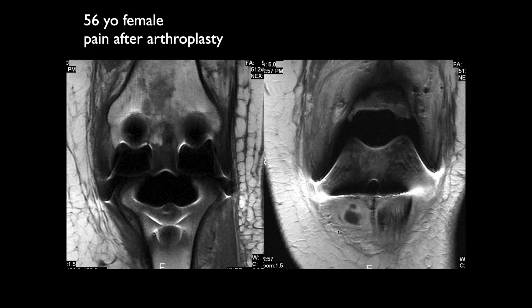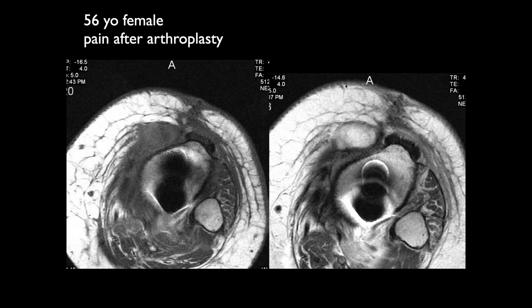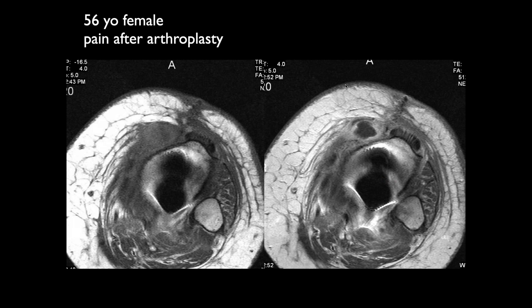This is a T1 — there's a small little fluid collection. So I'm thinking that's a small fluid collection right there. And those may, if they're not micrometallic artifact, they may be little locules of gas. So now we see that collection right there and it looks like an abscess — soft tissue abscess after arthroplasty.